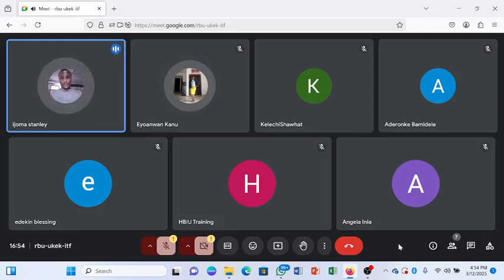Then you have another one, a red and a gray cap. You have a red with a tint of gray in between. Then the additives used here are clot activators and serum gel separator. The activator encourages clot formation, where the serum gel creates a barrier between the serum and the cells, which prevents contamination of the serum. It is commonly used for chemistry and immunology testing.